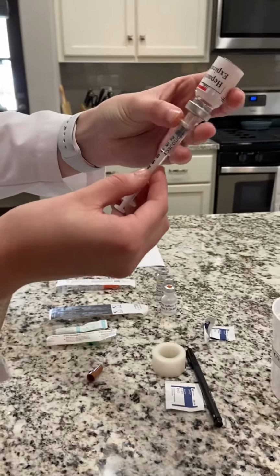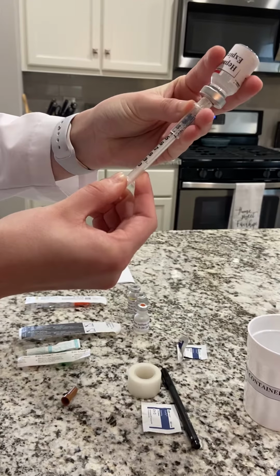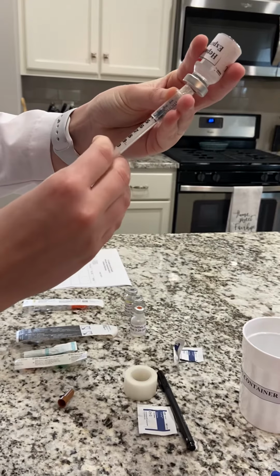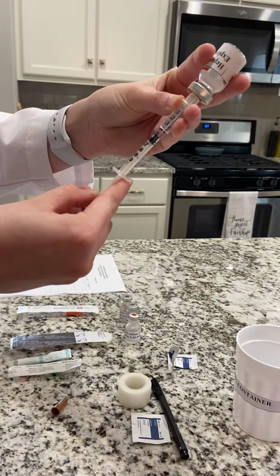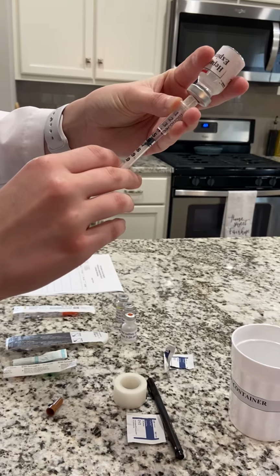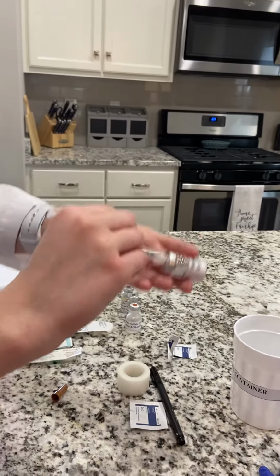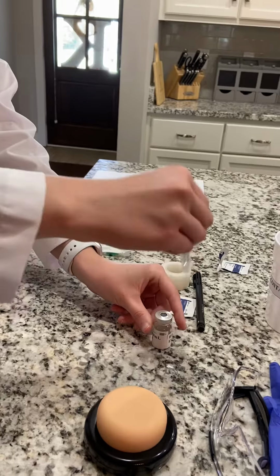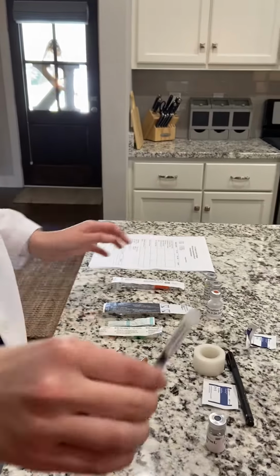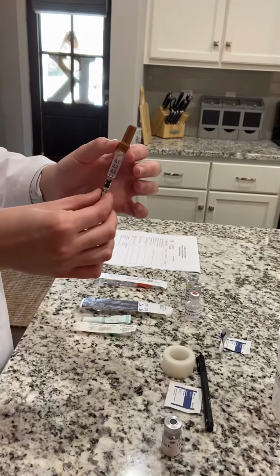And flip it. Now I'm going to get 0.5 milliliters. Okay. And now I'm going to scoop my needle, recap it.